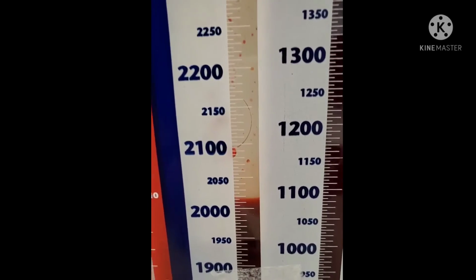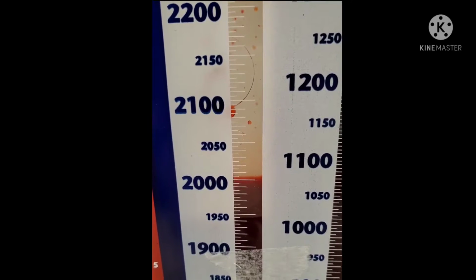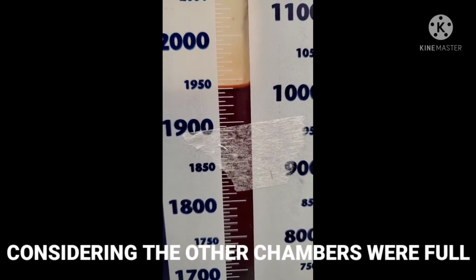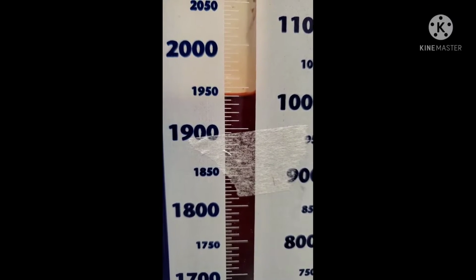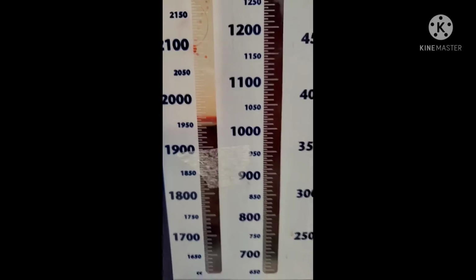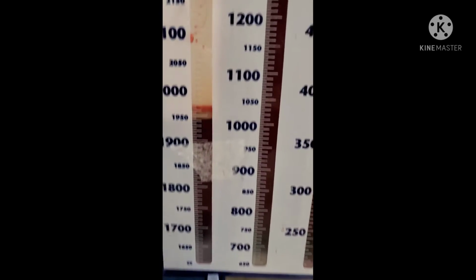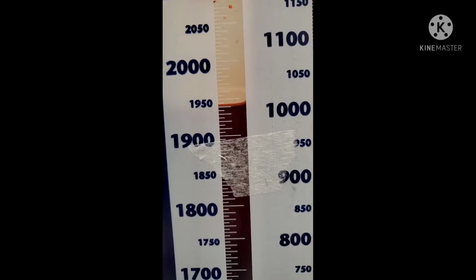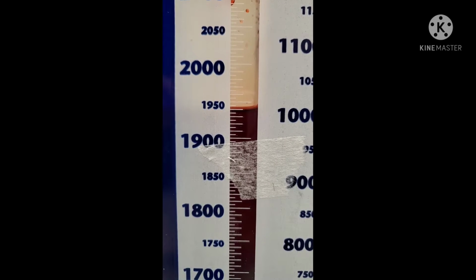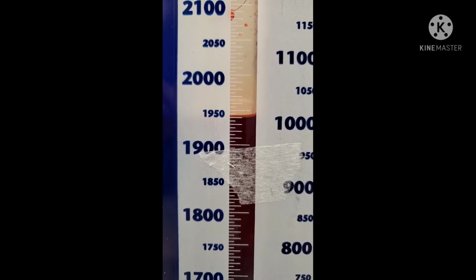So can you guys tell me how much drainage this patient has drained already? All right, so let's look at that. And you always want to look at eye level, because if I look at it from here versus if I look at it from below, or if I look at it right at eye level, it's going to be a different number, okay? So what do you guys think?